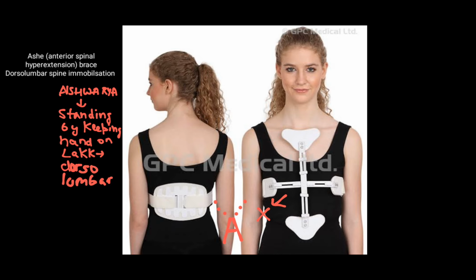Then next we have the Ashe brace. Ashe brace is used for dorsolumbar spine immobilization and anterior spinal hyperextension. How will you remember that it is used for the dorsolumbar spine? Imagine that A from Ashe and A for Aishwarya Rai.